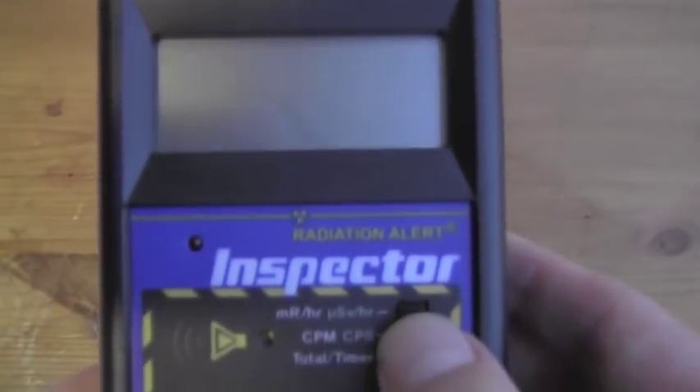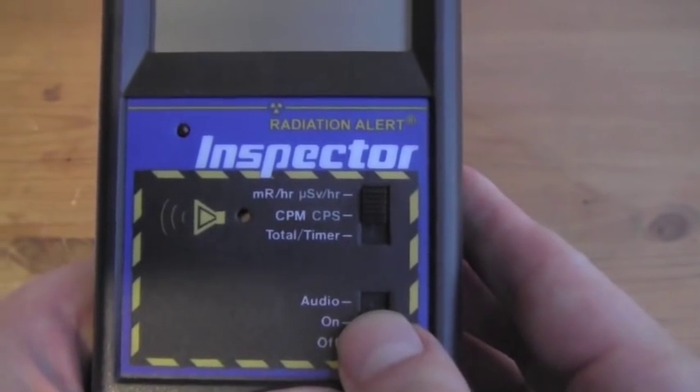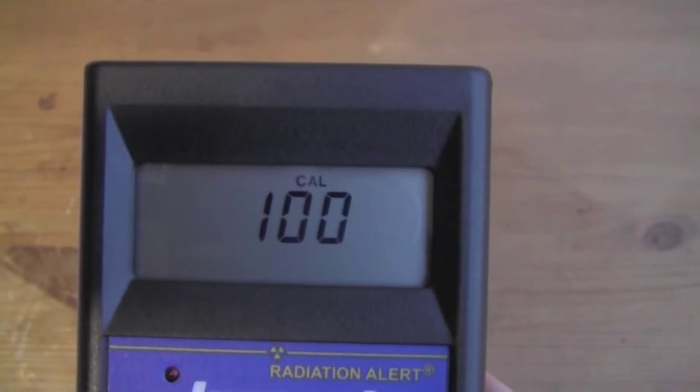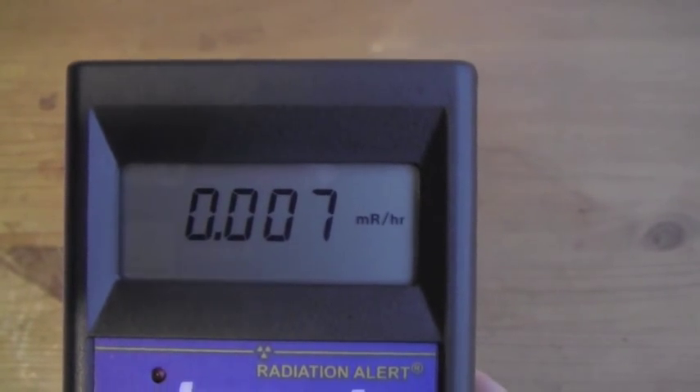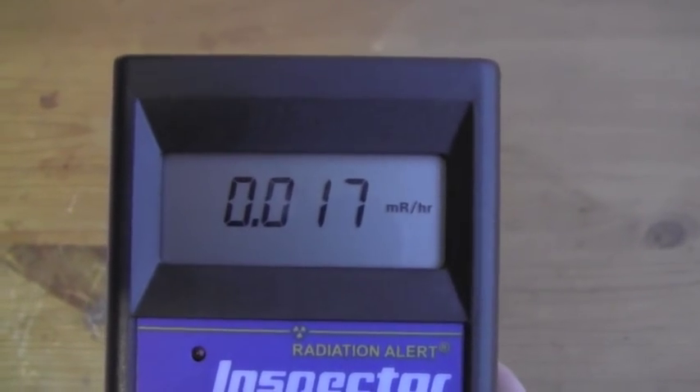To start the demo, we'll set the mode switch to dose and turn it on with audio. It's going to zero and measure background. For now, we're going to turn the audio off.